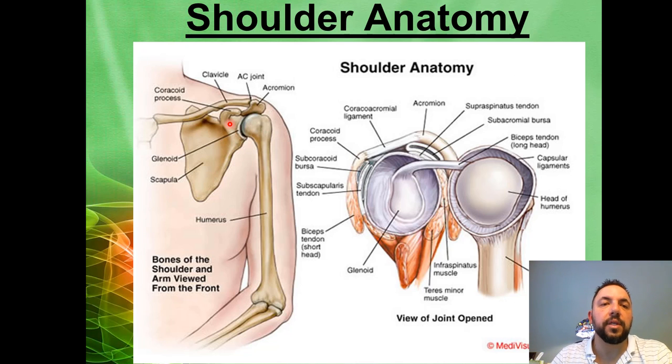So be mindful if the prescription or the referrer is looking for examination through and including the entirety of the scapula, that may require a flex coil, a larger coil with additional coverage both in the inferior dimension as well as the medial dimension. And really same applies for a clavicle as well. We'll look at a few examples of that.